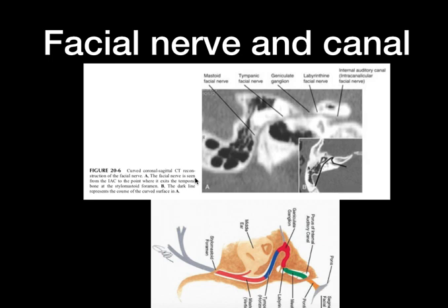Coming to the facial nerve and canal — there are various segments, and unless you scroll through the images you cannot see the entire facial nerve. A good oblique curved coronal reconstructed image can depict the entire facial nerve course in the temporal bone. You can see the mastoid portion, the tympanic segment, the geniculate ganglion, the labyrinthine segment, and the internal auditory canal. It arises from the brainstem, passes into the internal auditory canal, then the labyrinthine segment, turns at the geniculate ganglion, runs through the tympanic cavity, then the mastoid segment, and exits through the stylomastoid foramen. Look for the entire facial nerve canal, any erosions in cases of cholesteatoma or CSOM, and the rare entity of congenital absence of the facial nerve canal.